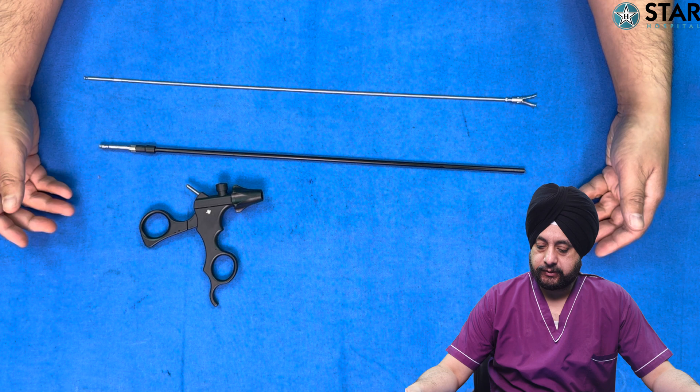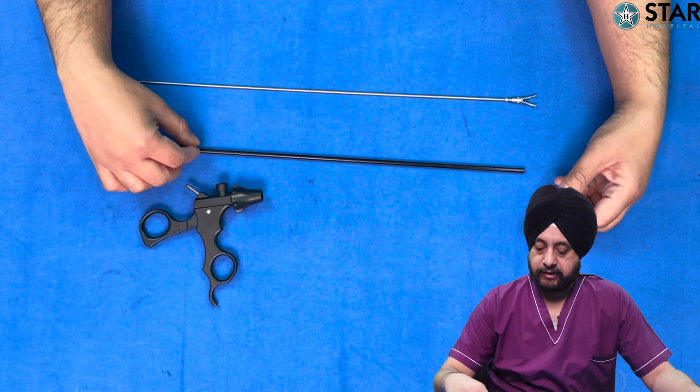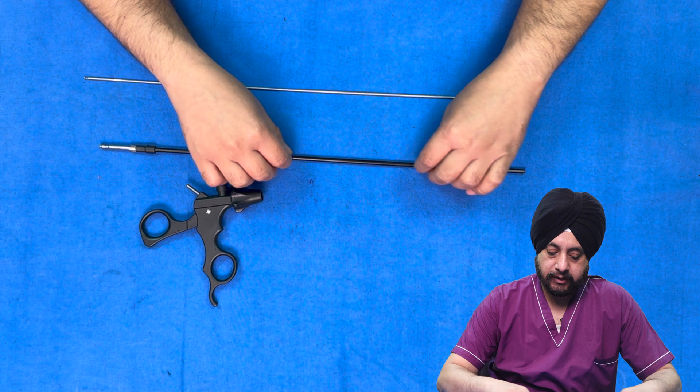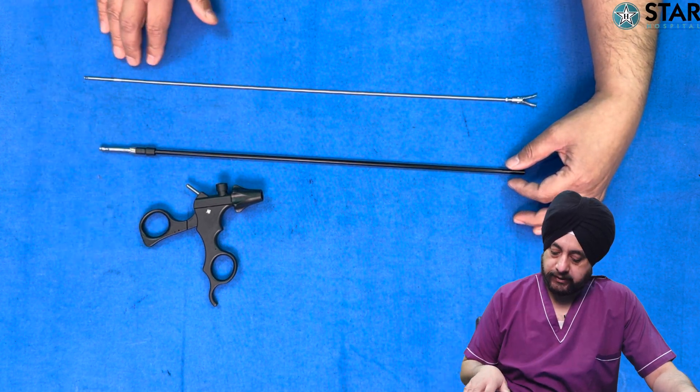We have opened one of the instruments — you can see these are the three common parts. This is the handle, this is the outer sheath which is insulated and black in color, and it protects the spread of current to adjacent organs. And this is the insert.